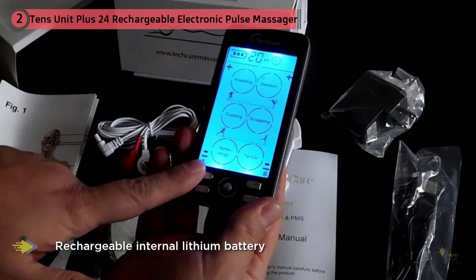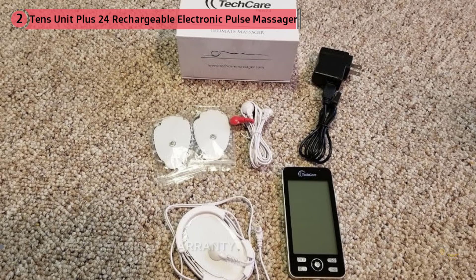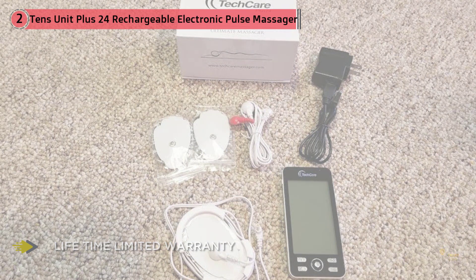The device is dual channel, which means you can treat two body parts at the same time. It has 20 intensity levels, and while not as many as our other two picks, it's simply enough to control the level of current and we're never found wanting for any more.